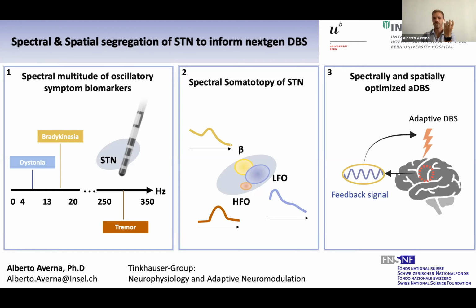And so it's not really so straightforward doing this job. The stimulation has to be triggered by using a pathological activity, but it's not that easy to find out what is a good trigger for the stimulation. So these are the main problems in my opinion. Yeah. And then I don't remember what was the second question, sorry.